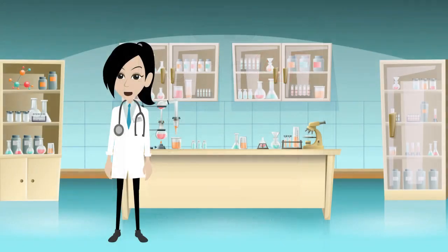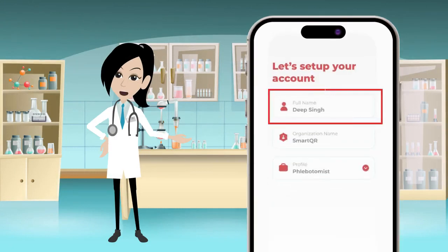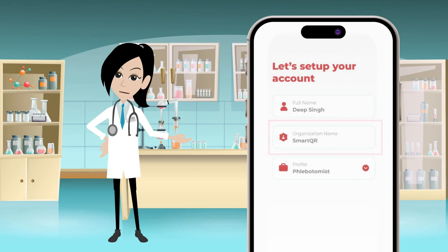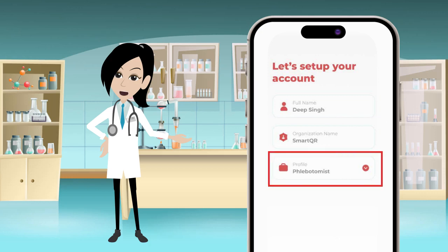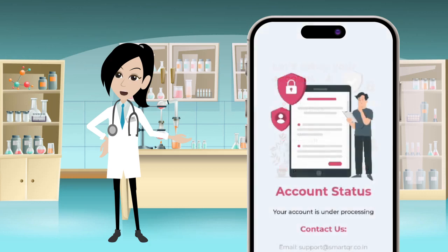Set up your account by filling in your full name, selecting your organization, and selecting your profile. Click Submit. We will provide you access in a few hours, then you can use the application for hemoglobin screening.